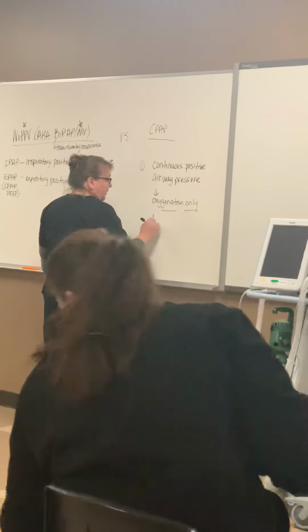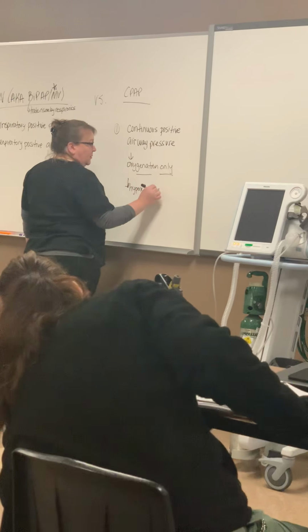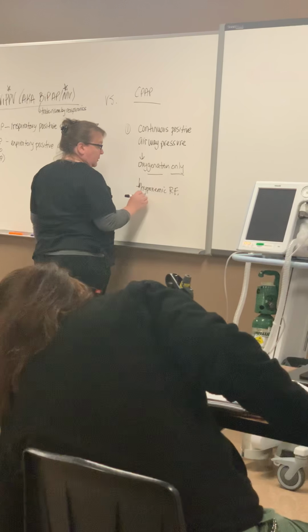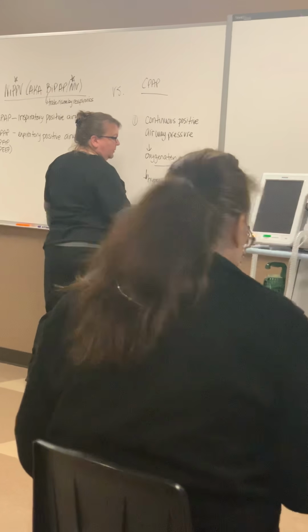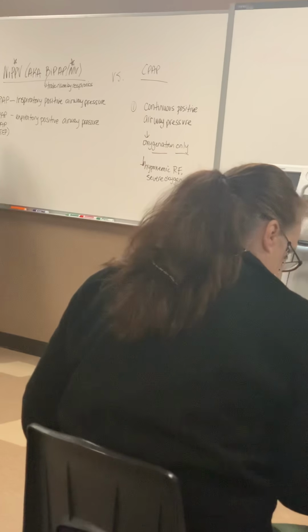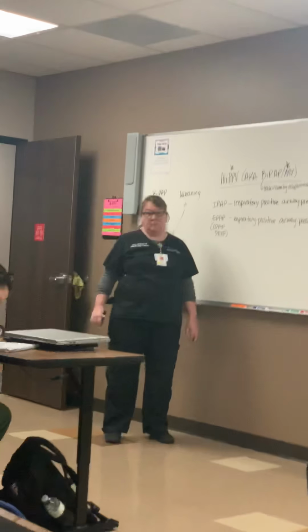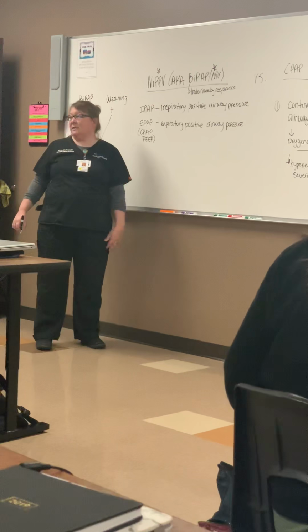So we could just put hypoxemic respiratory failure, severe oxygenation problems, however you want to word it. That's it. In the acute care setting, we just don't see a lot of CPAP.